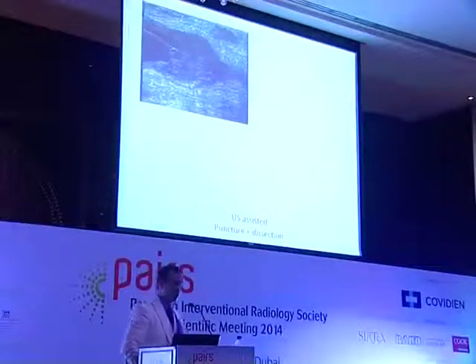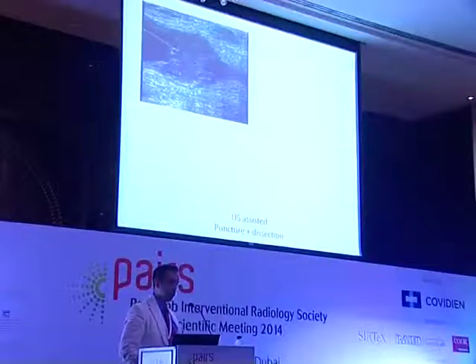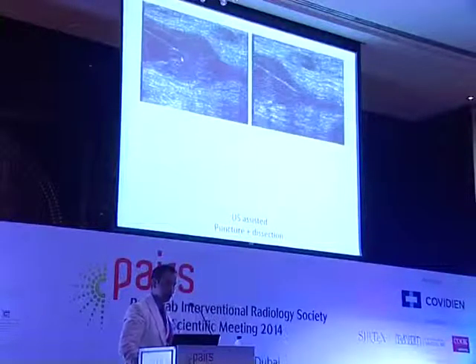So what we decided to do is to puncture antegrade using ultrasound. Here you can see the needle in the common femoral artery puncture site and this fibrotic cuff which we have to cross with the needle. And like this, we can start.